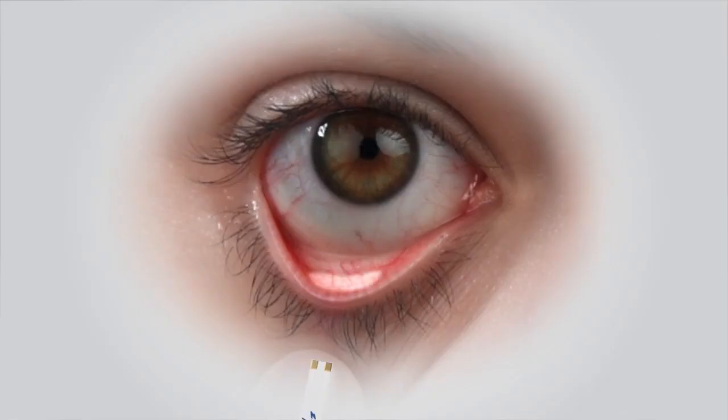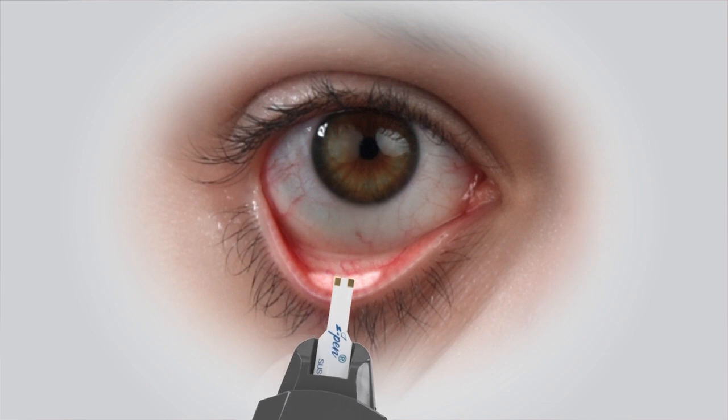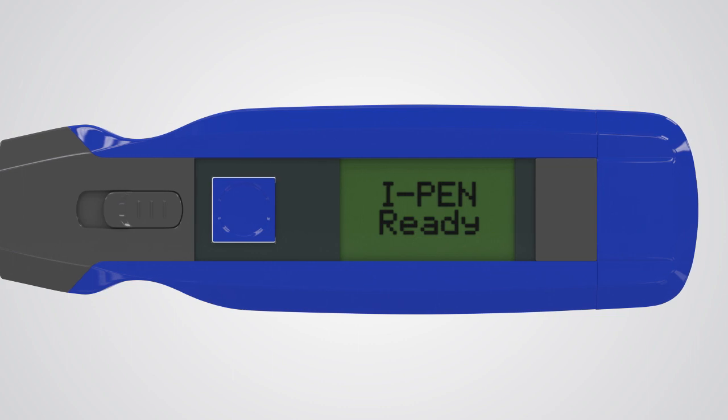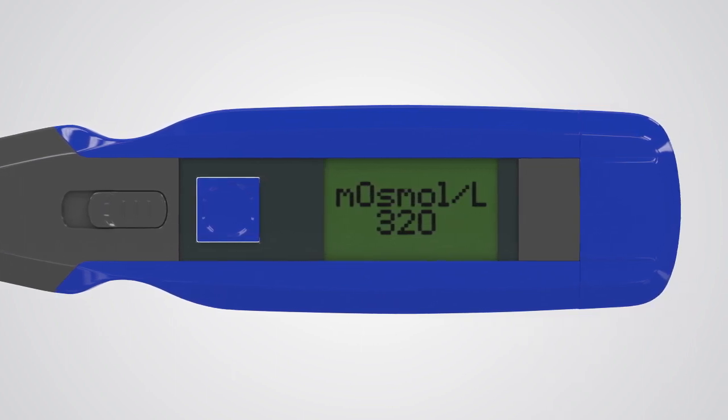When correctly placed, the tip of the single-use sensor should be depressing the surface slightly so both gold terminals on the tip of the single-use sensor are in good contact with the conjunctiva. The iPen will emit an audible beep after taking 250 readings in several seconds and will display the results on the LCD screen.